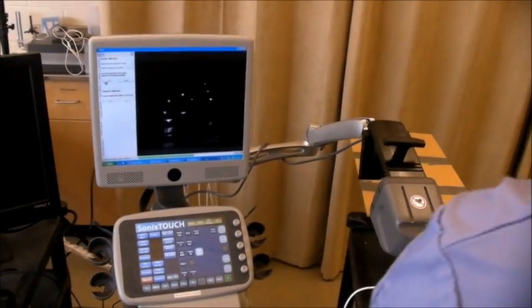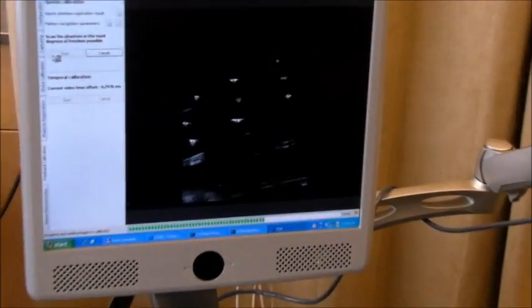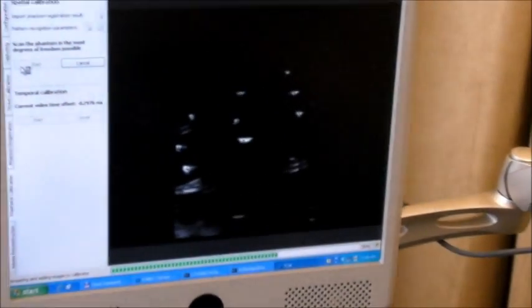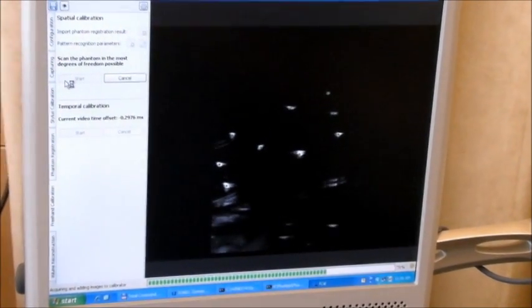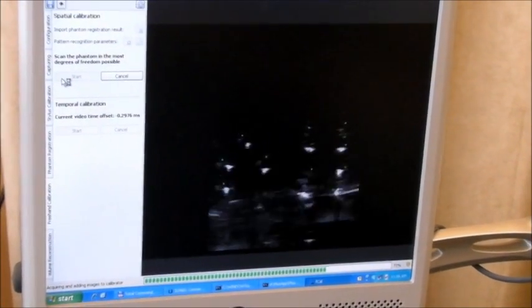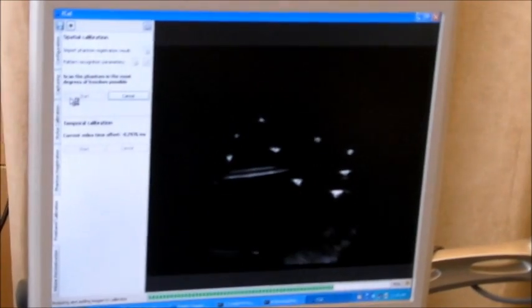If some images are not added to the segmentation, it's not a problem, because then the progress bar doesn't move. You can continue whenever you find the good spot.